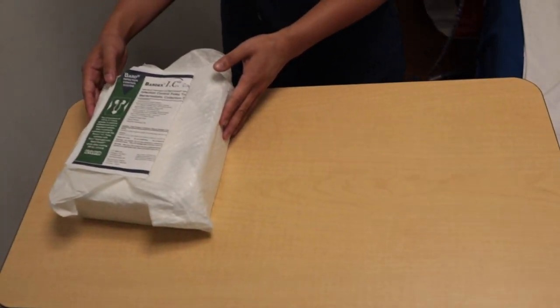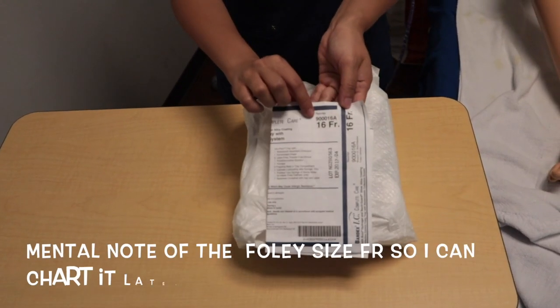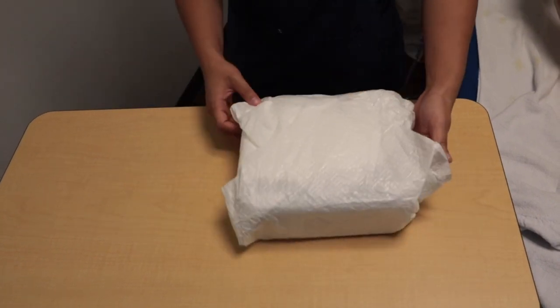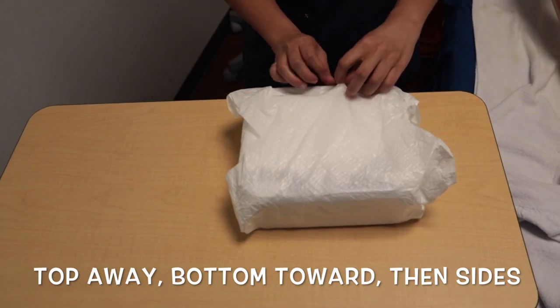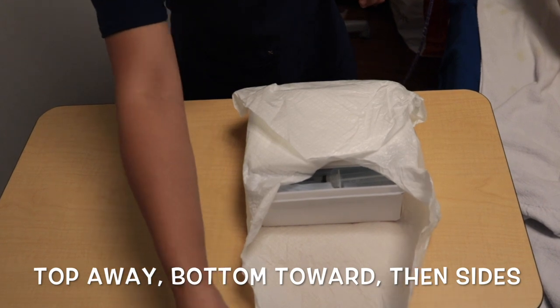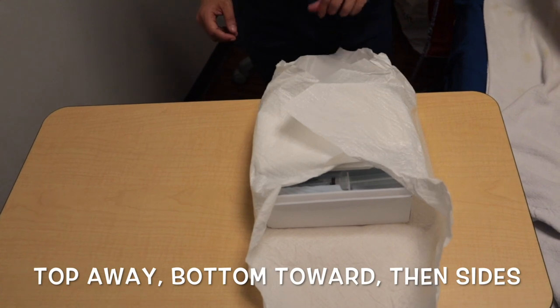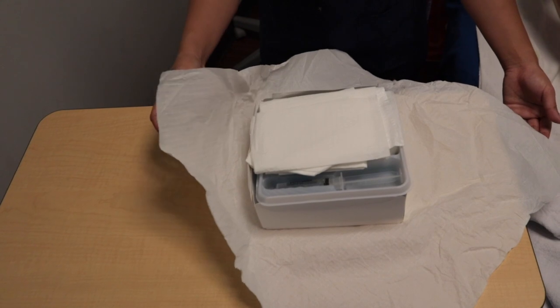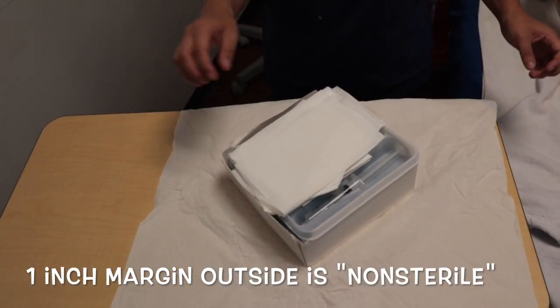A label will come with the kit and usually give you information on what is included in the kit. I like to make a mental note of the size French so that I can chart it later. Start by removing the top flap away from me. Then the bottom flap. Then the side, and then the other side. Imagine the 1-inch margin outside is non-sterile, so you can touch that but not any more past it.